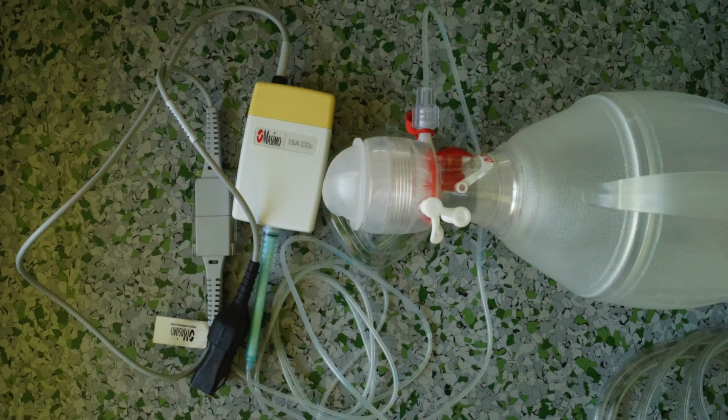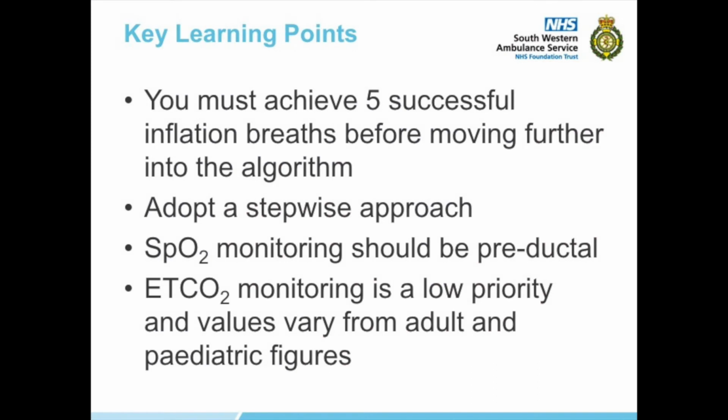When using a supraglottic airway or BVM at this stage of the resuscitation, utilize end-tidal capnography. The values are unlikely to correlate with adult and pediatric guidelines, but they will provide evidence that gaseous exchange is taking place.